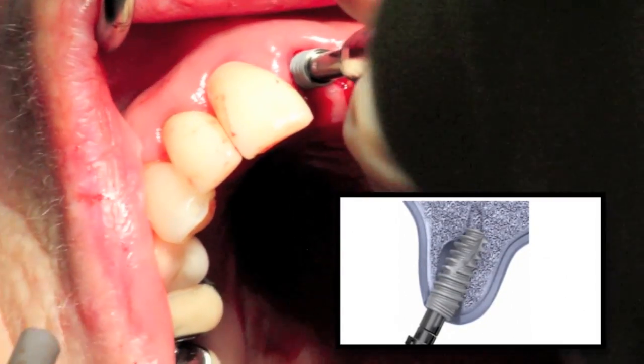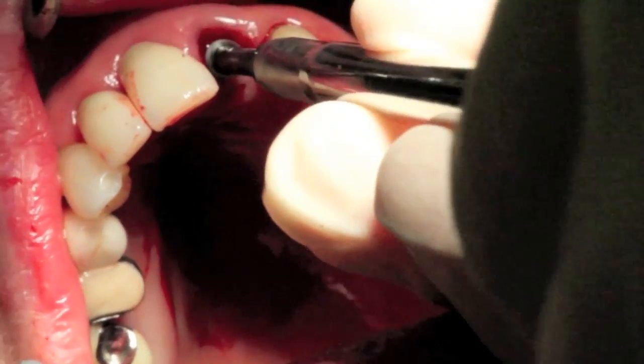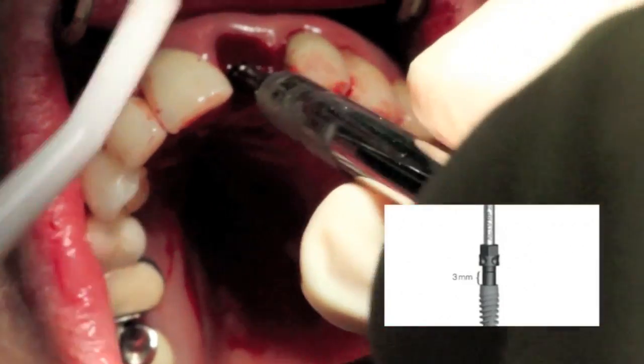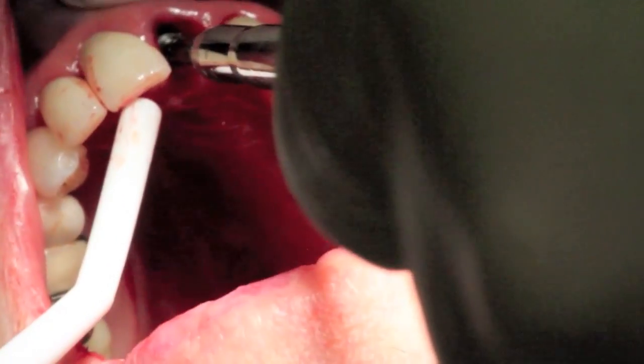We actually start very, very buccal, and we want to do this on purpose. So we start buccal, so the threads are so aggressive and stable that we're able to rotate this implant as we go in. So as you're going into that osteotomy, you rotate your hand backwards into that lingual position.